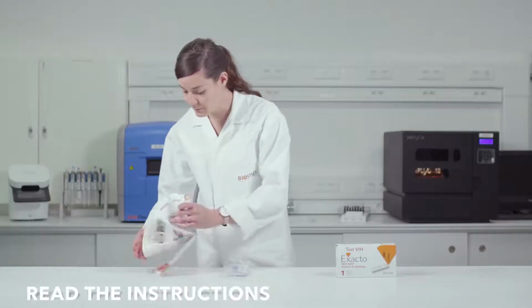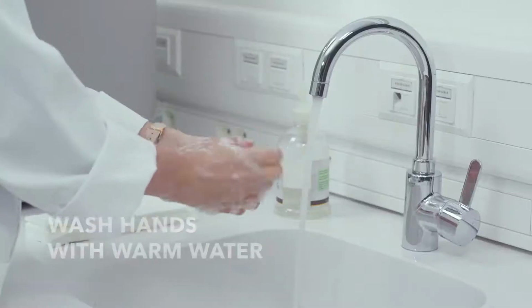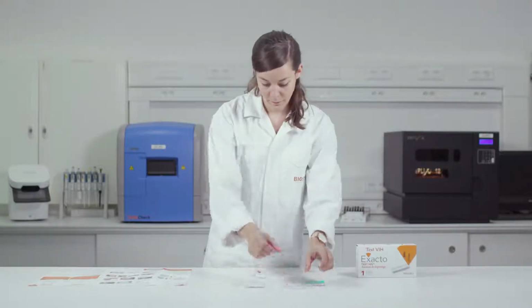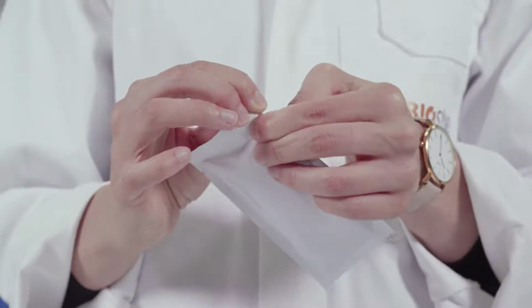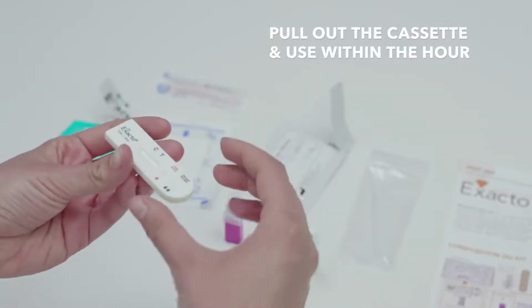Before taking the test, make sure you are in a calm environment and read the instructions carefully. Before taking the sample, it is important to wash your hands with warm water in order to stimulate the blood circulation. Make sure each item is included in the kit and identify them while placing them on a flat and clean surface. Open the pouch and take out the test cassette. You will need to use it within 1 hour after opening it.